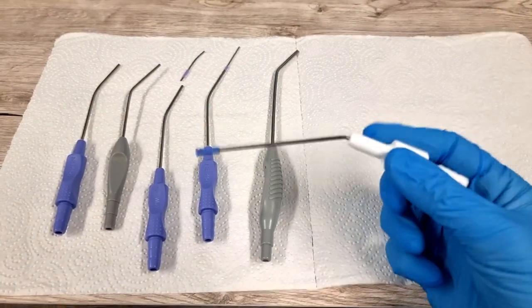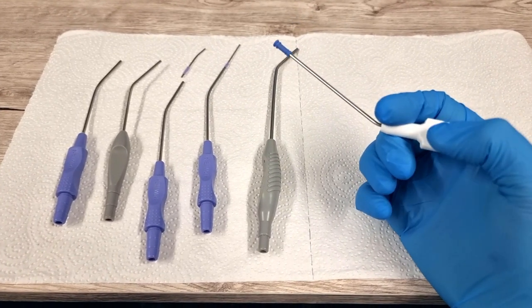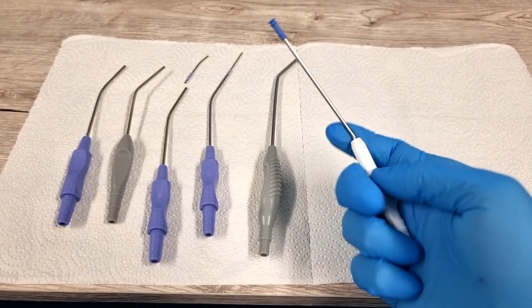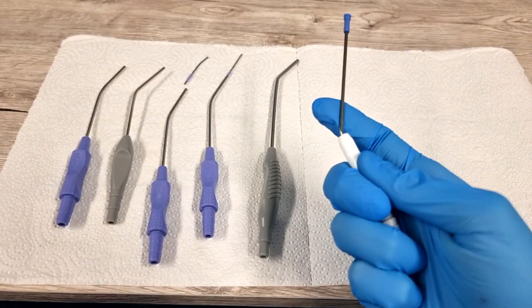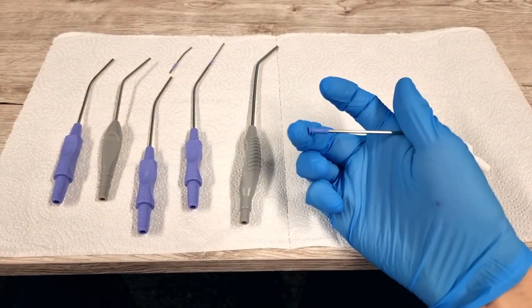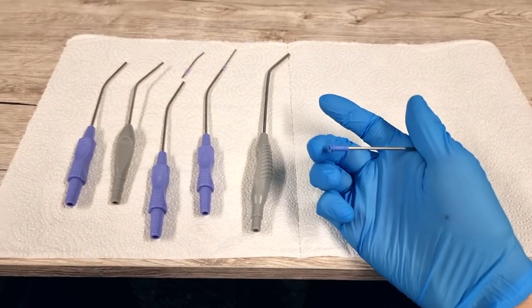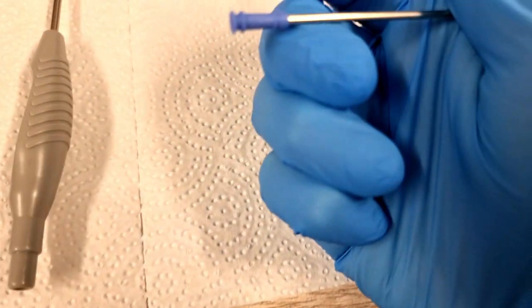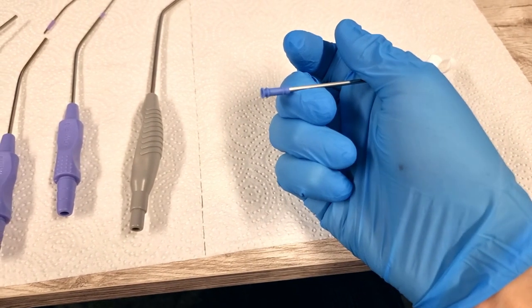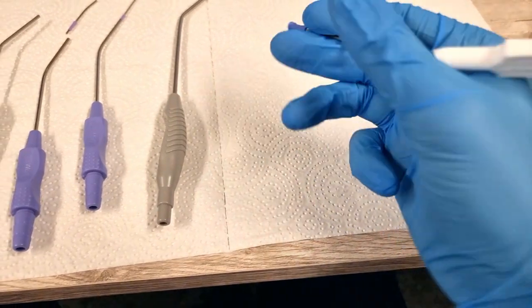And then the Clearway, this is from DTI Medical. I did a video on this a while ago. It has a control hole here, and it spins like that, so you can get the orientation you want. This soft cup at the end will allow you to latch on to hard things, so foreign bodies like marbles, beads, and hard pieces of wax. I'll link the Clearway suction video down below. It's quite a cool concept, but again, it's fairly large and not practical for most cases.